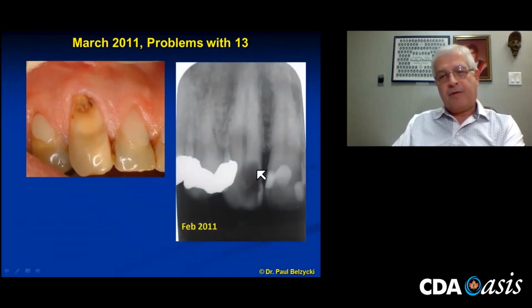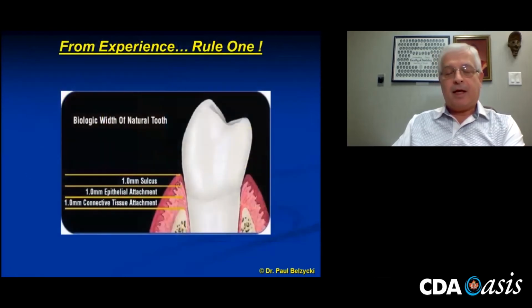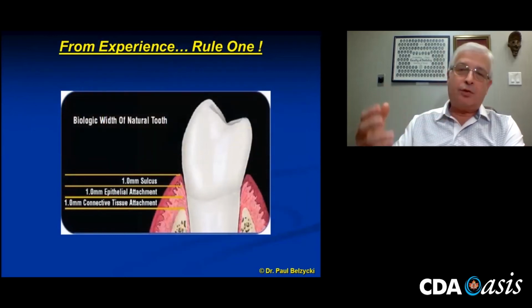Took a radiograph, and there's a lot of decay. So that I knew was existing, but I looked at the facial surface here, and I thought, that looks to be a problem too, because on the radiograph, I could see there's a certain radiolucent density to the canal in this area, but in this area, the canal is more pronounced. So I knew there was a loss of hard tooth structure, making the canal look that way. So the first thing I have to address is this tooth restorable?